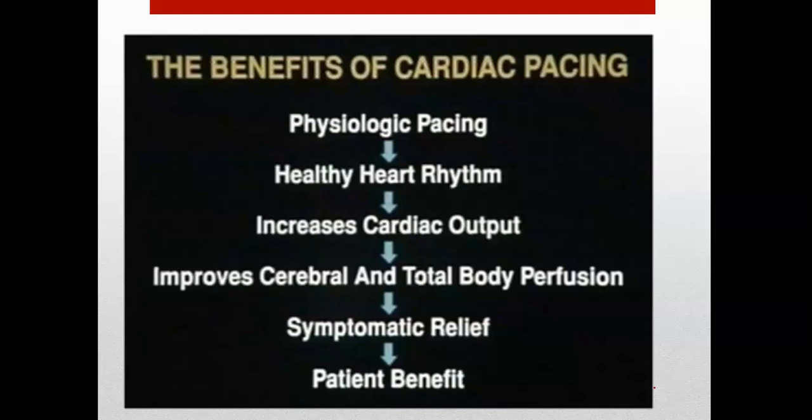Okay, so what are the benefits of cardiac pacing? The benefits really include just a maintenance of the regular heart rate and rhythm, which is going to increase your overall cardiac output. So that's obviously going to help you from an overall standpoint. It really helps improve perfusion because of that cardiac output to all of your organs and tissues. That improved perfusion is also going to improve oxygenation to our tissues, which in turn provides relief from pain and other symptoms that are associated with oxygen imbalances.